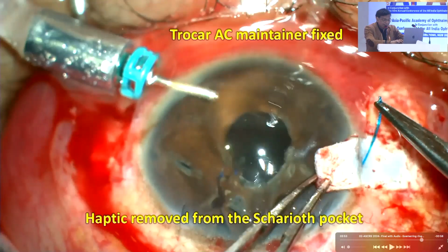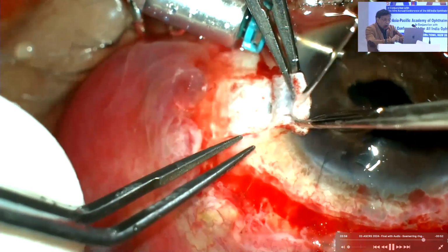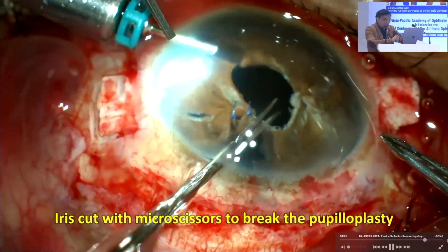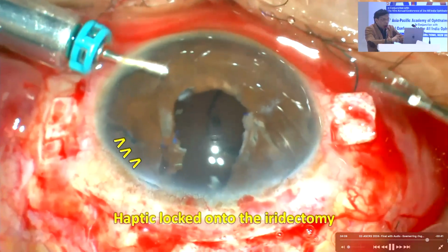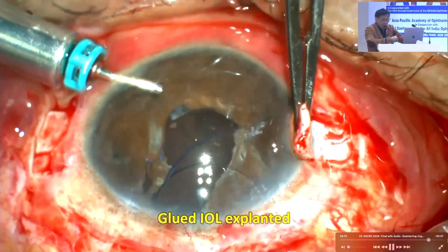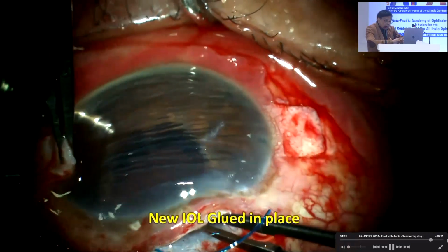Refer to Amar. So now I have dislodged the haptics. This is just 1 week post-op, okay? And now I've dislodged the haptics. Now my problem is I take a scissor and I'm cutting this pupil. So I've enlarged it because I know I have to take it out. Now look what's happened to that haptic. It's got stuck in the iridectomy there. I'd created a peripheral iridectomy, remember? So it's got stuck there. So I had to dislodge it. Now slowly take it out.